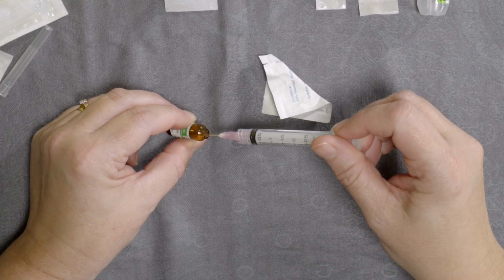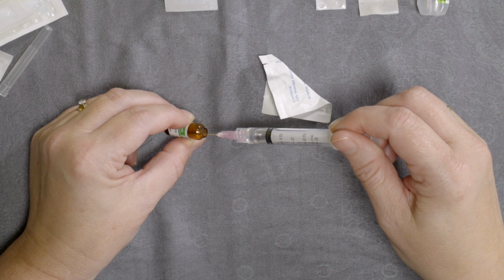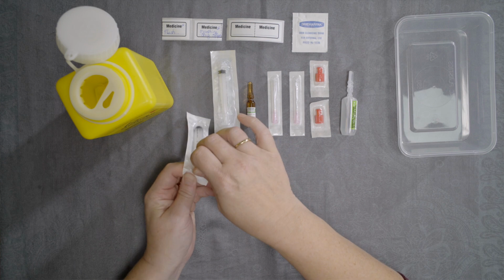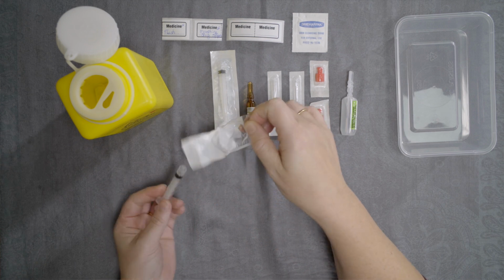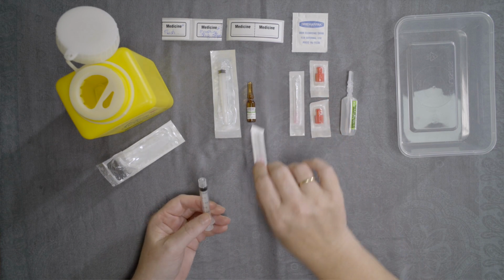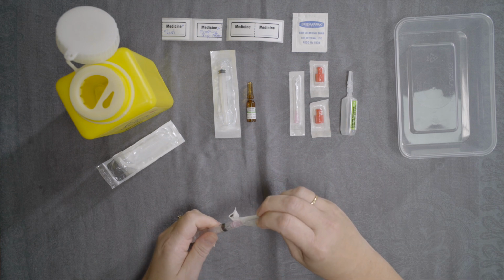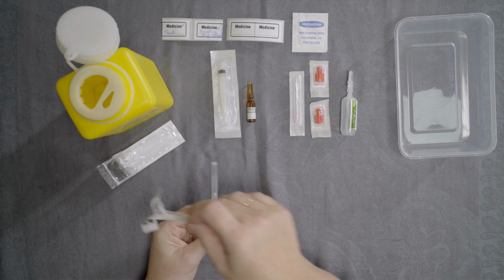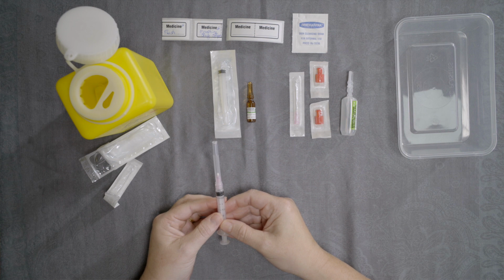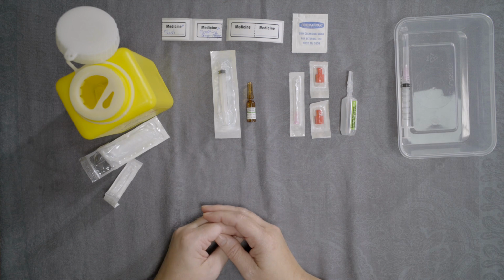The aim is to get the medication into the syringe from the ampule by drawing it up with a blunt needle. To do this, start by opening the syringe, being careful not to touch the narrow end. Also, open up the needle. Leave the cover on at this stage and push it straight onto, or screw it gently, onto the narrow end of the syringe. You can now place the empty syringe with needle attached back into the container until ready to use.